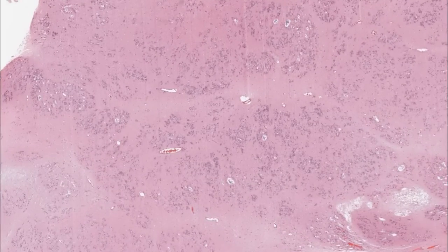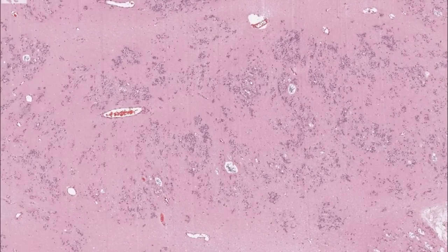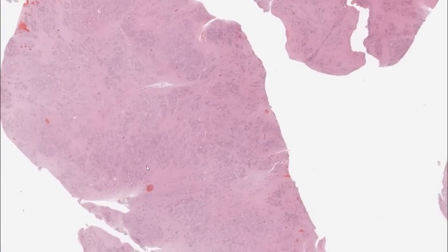This is a diagnosis that we say in surgical neuropathology is a one-second diagnosis, and it's a diagnosis that you make at low power. The feature you're highlighting here is this clustering of round to oval nuclei, not much variation, in a very nice glial background with a lot of nodularity. In an adult, in an intraventricular location, all these features should point you to the diagnosis of subependymoma. It's an important diagnosis because it's a favorable tumor. These tumors grow very, very slowly, and they are curable by resection. Even with partial resection, they may be inactive for long periods of time.